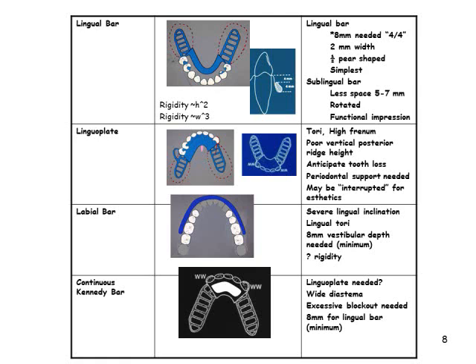The mandibular lingual plate is 1/2 pear-shaped with the bulkiest portion inferiorly located. A thin metal apron extends superiorly, to contact the lingual surface of anterior teeth and involved posterior teeth at their height of contour. The apron is extended to the height of interproximal contact points, that is, closing interproximal spaces. The apron is scalloped. The superior border is finished to a continuous plane with contacted teeth. The inferior border is at the height of the floor of the mouth, when the patient's tongue is slightly elevated.